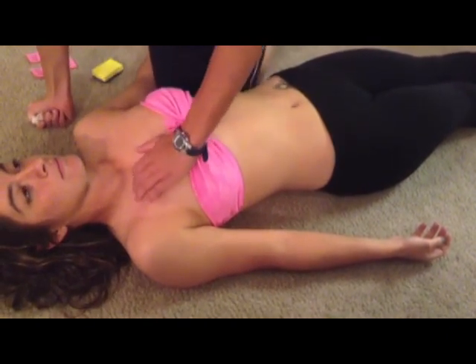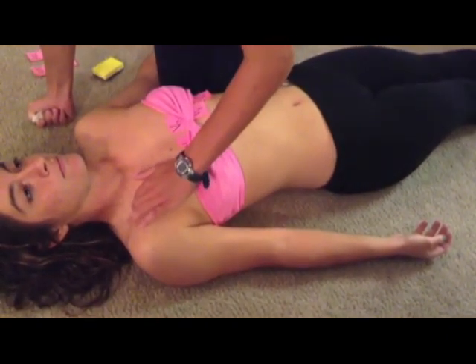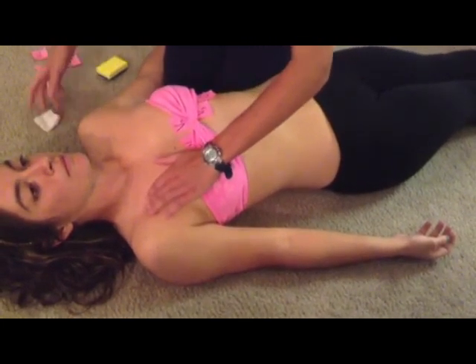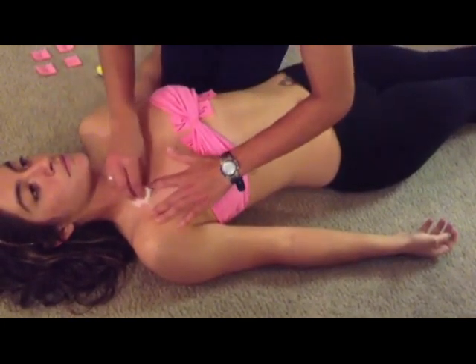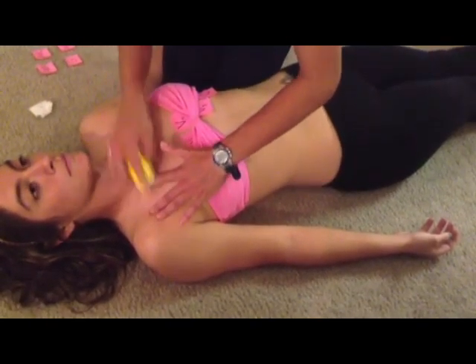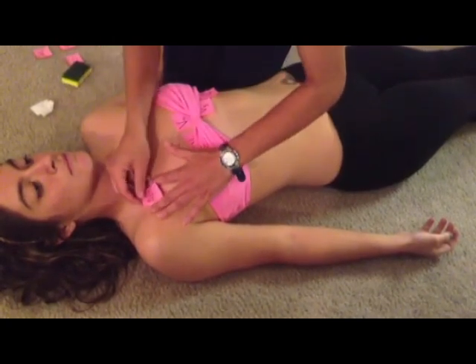We start on the right side, locating the clavicle and palpating the area right below it, which is called the infraclavicular fossa. Clean this area with an alcohol pad, followed by an abrasive pad, and then place the AVR electrode.